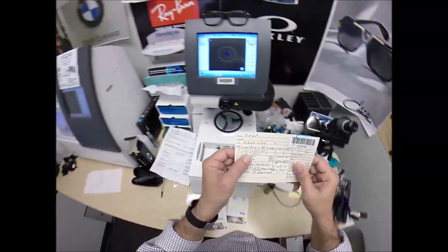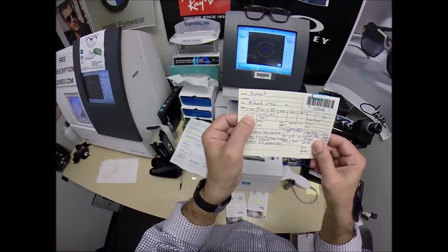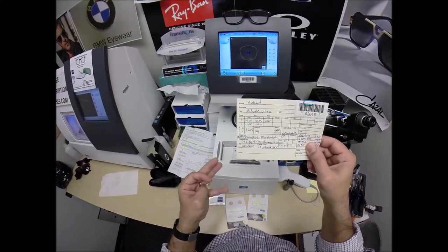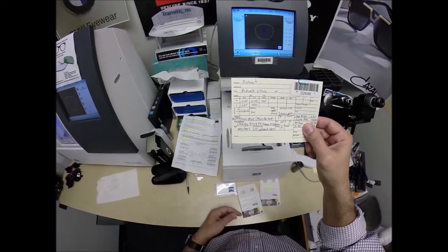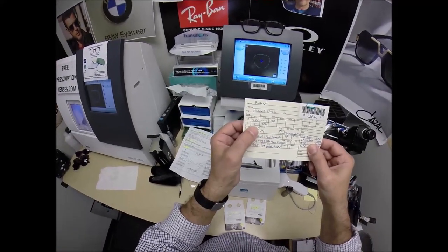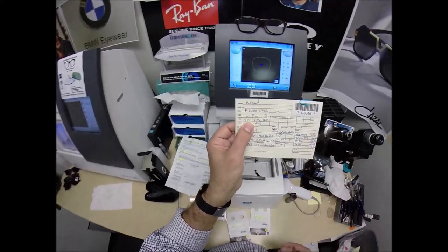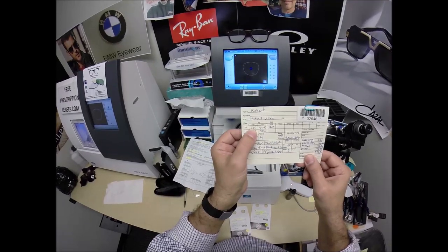Now, with your glasses off, everything is much too large. So that's why there's a minus sign. Your lenses are minified four steps. Everything starts in quarter increments. Well, it starts at zero, which we in the industry call plano, which people in Texas call a city. But it goes up in quarter increments: 0.25, 0.50, 0.75, one. So you're on the fourth rung of a ladder to make everything the correct size.